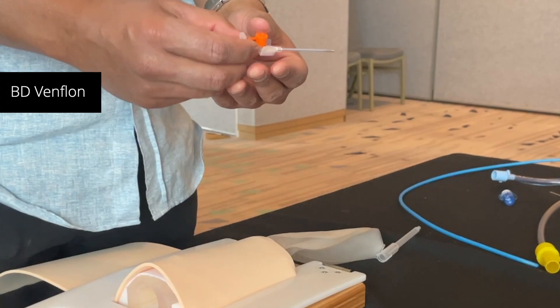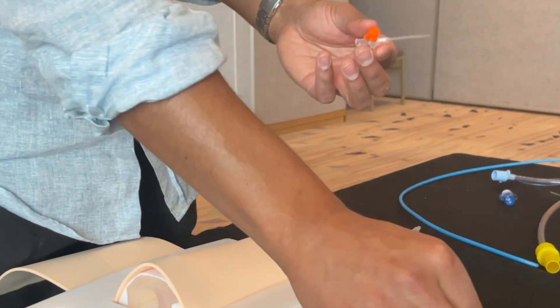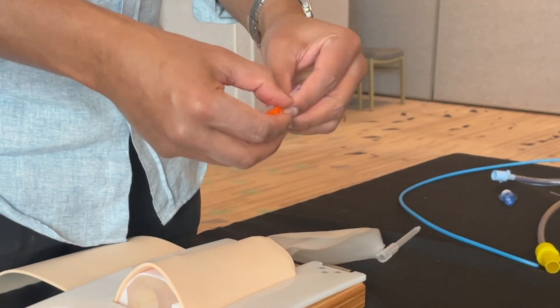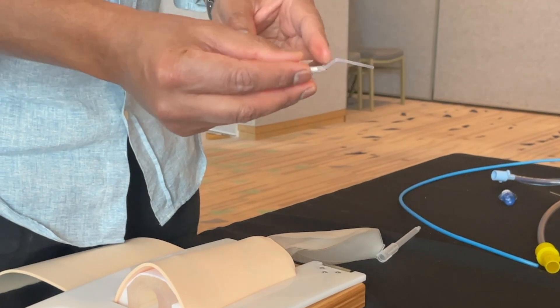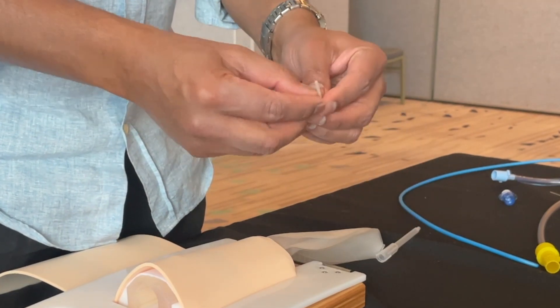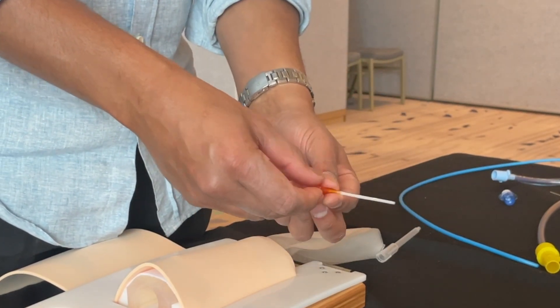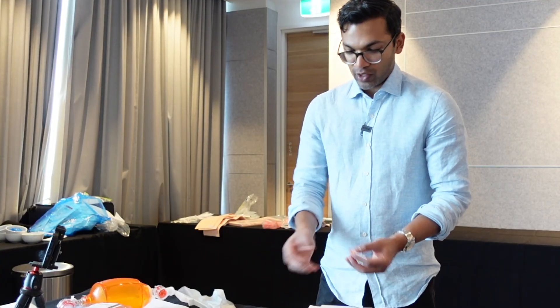This cannula is a BD Venflon. To show you the mechanics: if I kink this cannula, it seems to stay obstructed, as you can see. Whereas the BD inside cannula doesn't have that problem — it springs back to normal and stays patent. Again, really useful when you're doing surgical airways.